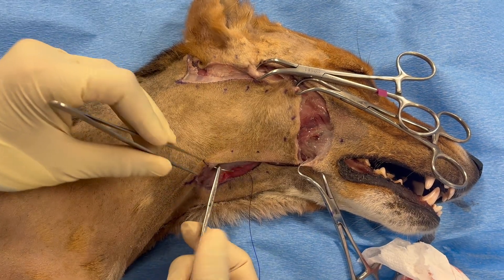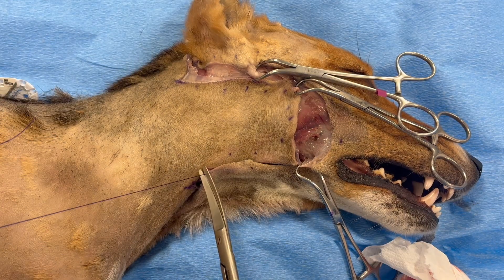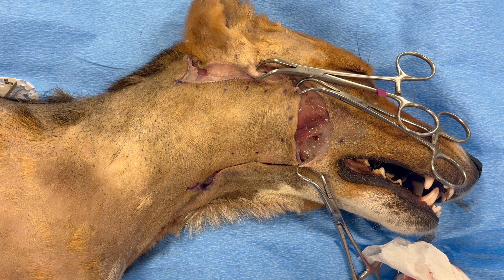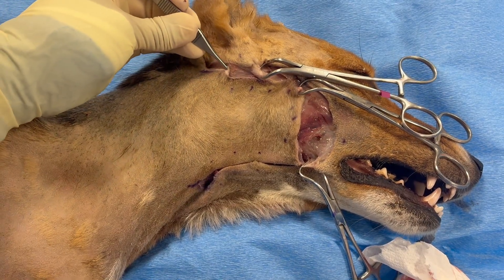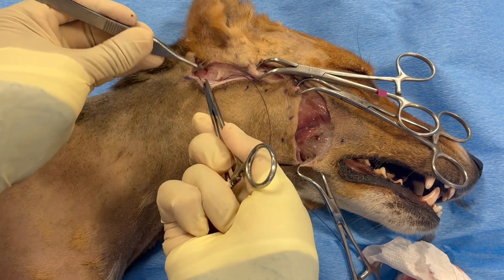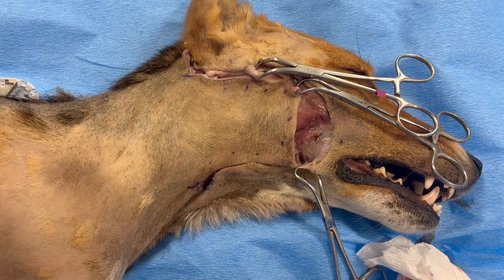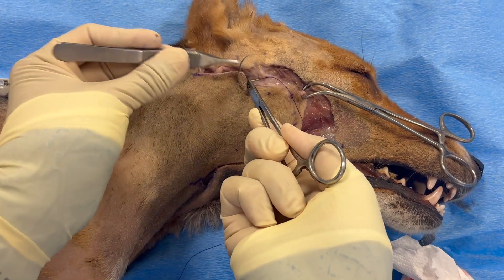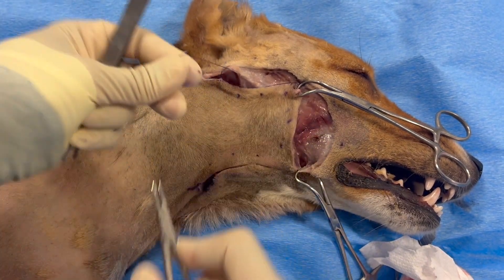The flap is held temporarily in place with some towel clamps in the skin or subcutaneous tissues. With each of these interrupted deep subcutaneous sutures we are going to pull the flap forward or cranially — the corresponding site of the suture bites is offset, and as demonstrated here we bite relatively caudally, pull that skin forward, and then take a bite more cranially, so we're fudging the sutures.